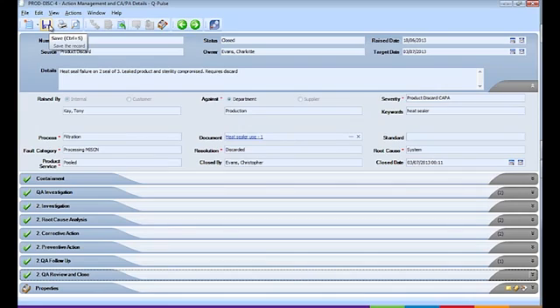Okay, so what have we achieved so far? We've recorded the blood product discards, we've entered the number of units discarded and the cost, we've put in place actions to reduce blood wastage, and we've completed this by following a defined workflow with the purpose of identifying root cause and applying corrective and preventive actions. It's in a controlled manner, and so internal processes such as component processing, testing and distribution can be revised and improved to help reduce wastage. And this also pushes data through to the analysis module.